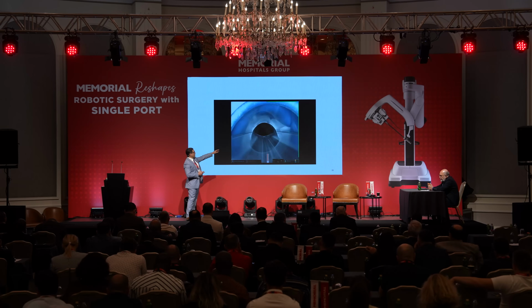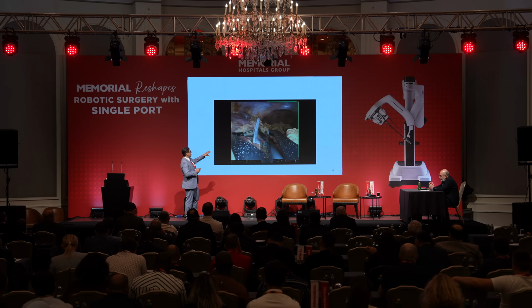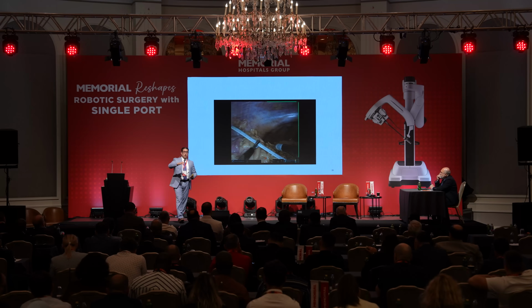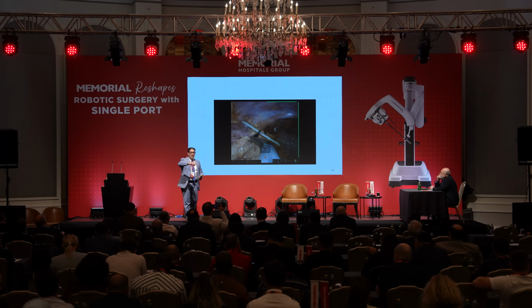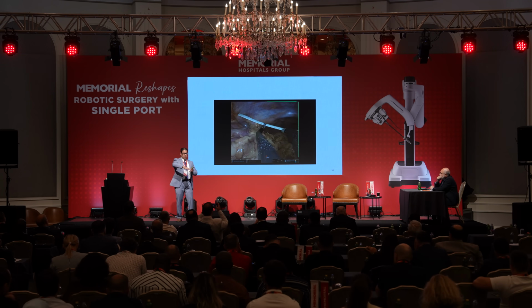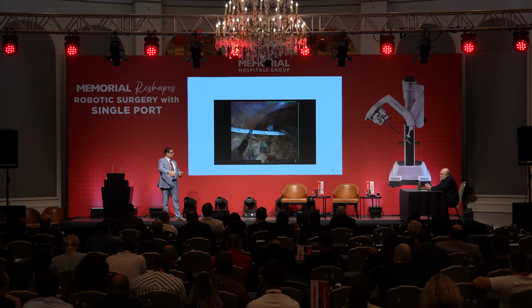This is another one when you're going and hitting, but this is from the robotic view. So your assistant, when you get the camera out, and you have been pulling on the abdominal wall, and the assistant gets the camera out, they cannot put it back in. They have to shift the port to be one line through the hole. Otherwise, you will hit the side, the wall of the ileostomy.